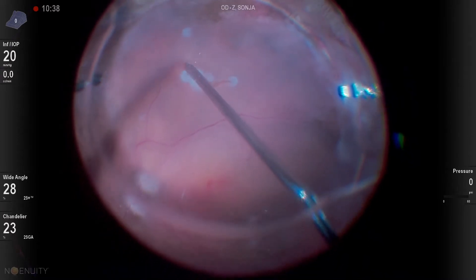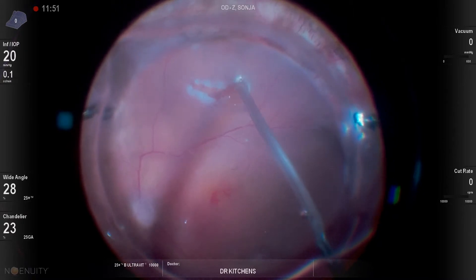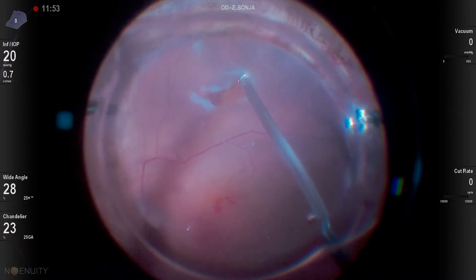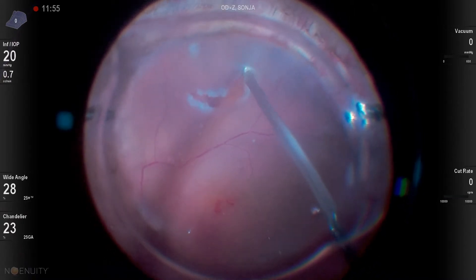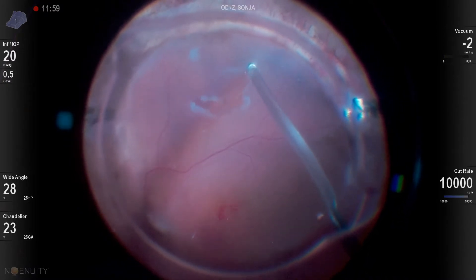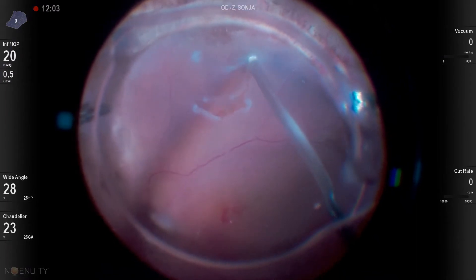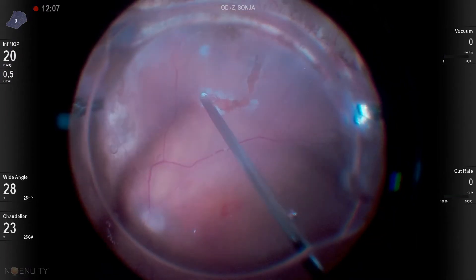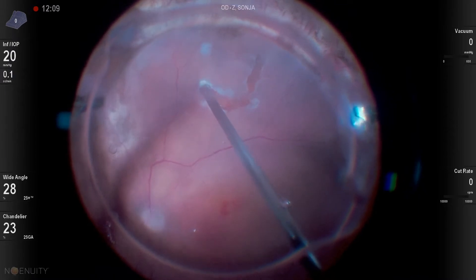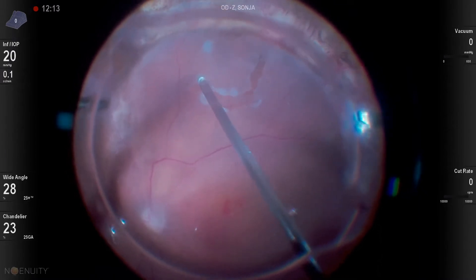Here we are inferiorly where she is detached from this PVR under silicone oil. We're harvesting a retinal transplant to put over her macular hole that's under silicone oil. I start with the curved scissors but unfortunately just can't get the right angle with those, so I go to the 25 gauge cutter — which under oil really works great for this.